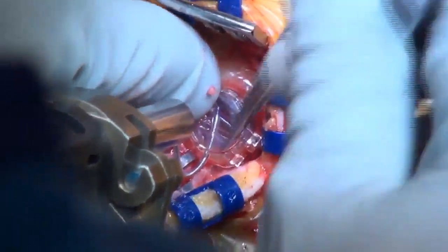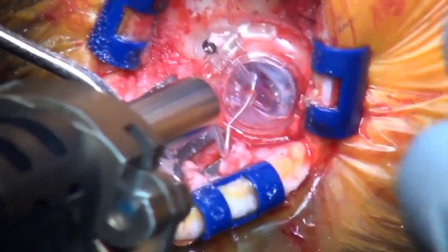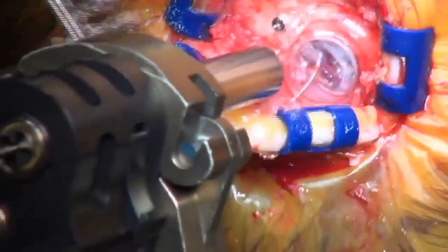Push it down like this. There we go. Okay. So you can see here what that looks like. What I just did, I placed a little cap on top of the stim lock. So this is the device that both clipped it and then capped it down to lock it in place. And now we're ready for our CT scan to verify lead position.